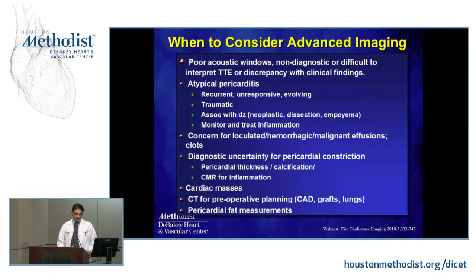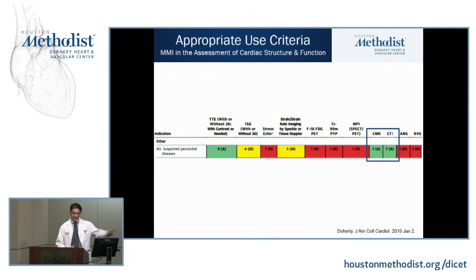So thank you very much. Please consider the advanced imaging techniques in your difficult patients. And don't forget, there are recently published appropriateness criteria for pericardial diseases, both with CT and CMR.